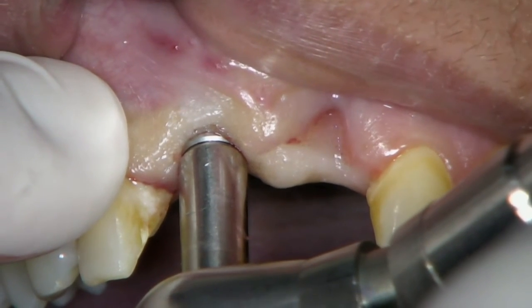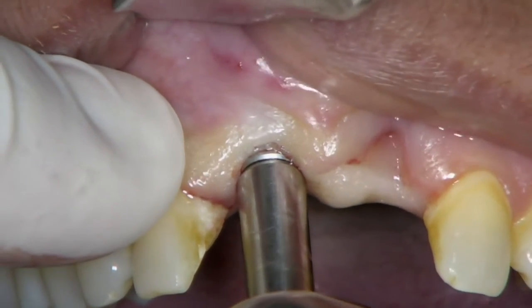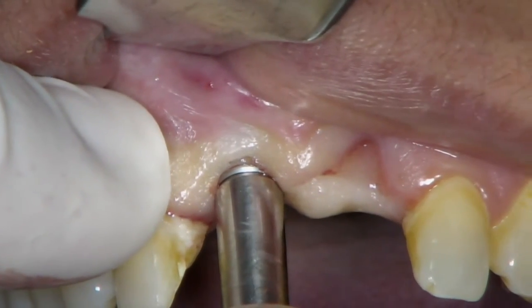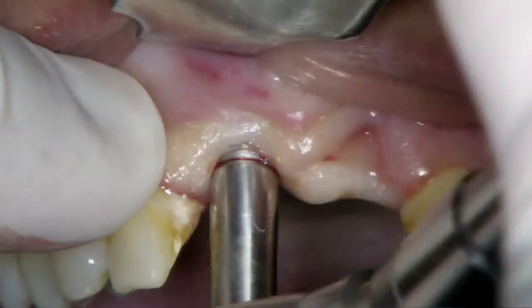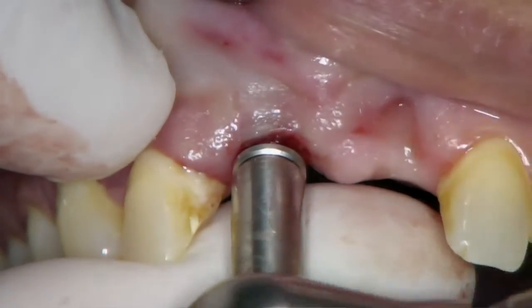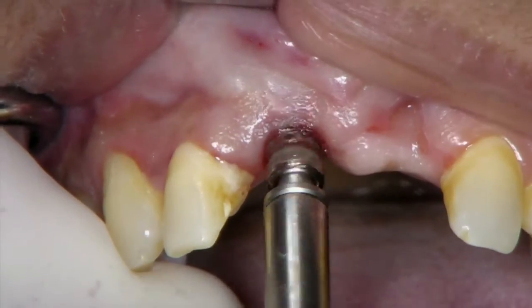It is critical to use this instrument cautiously with a great amount of control, as any excessive force can result in fracture of the implant, bone, or possible injury to the adjacent teeth. The implant is then rotated out and removed.